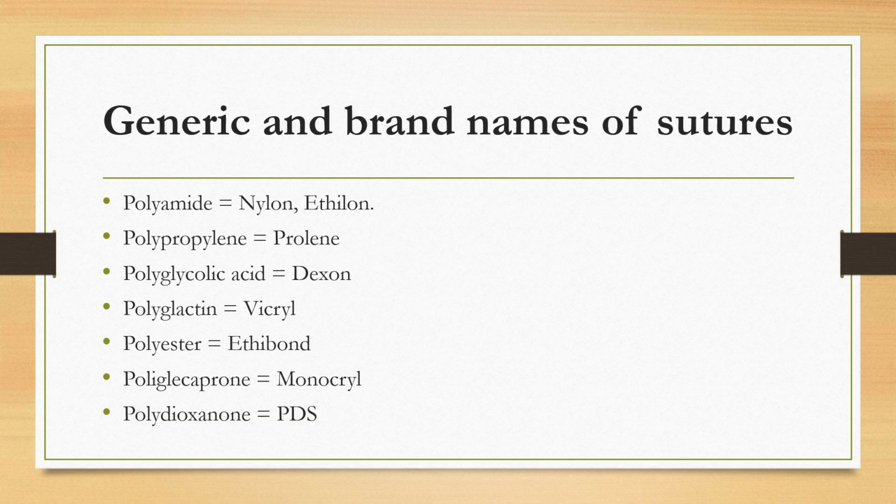Okay, so it's a cardiovascular kind of suture material, usually handled by a special kind of instruments. The needle holder that is used to handle the stainless steel suture is called a sternal needle holder. It is a special kind of needle holder, and it's used, as we said, to approximate the sternum in open heart surgery.